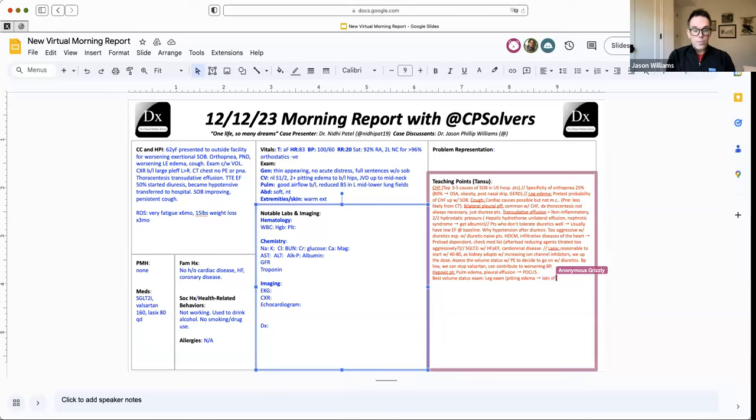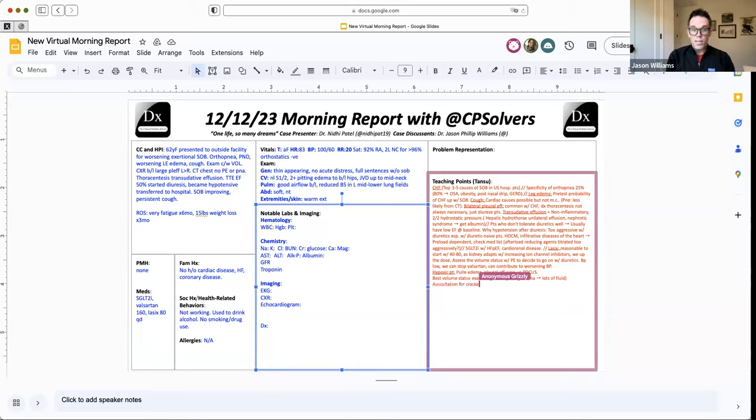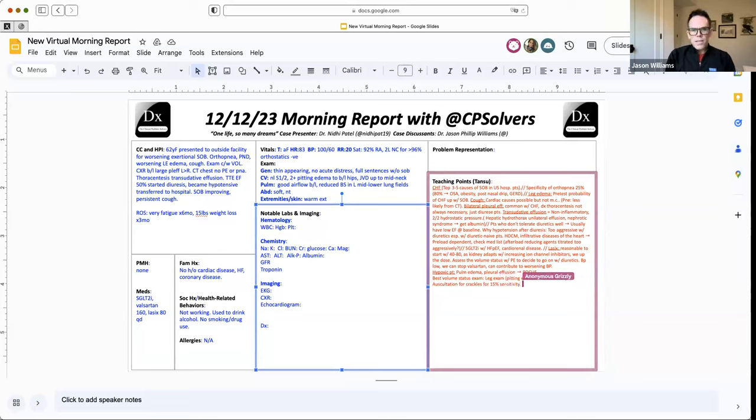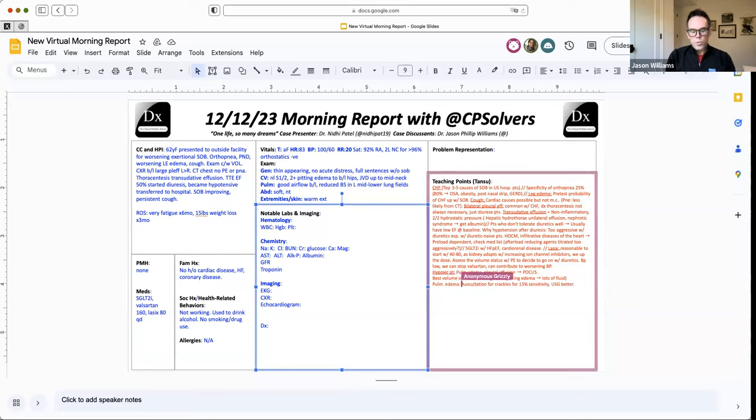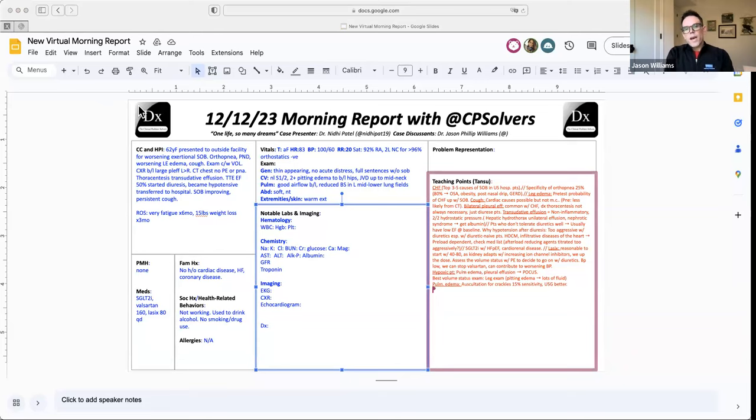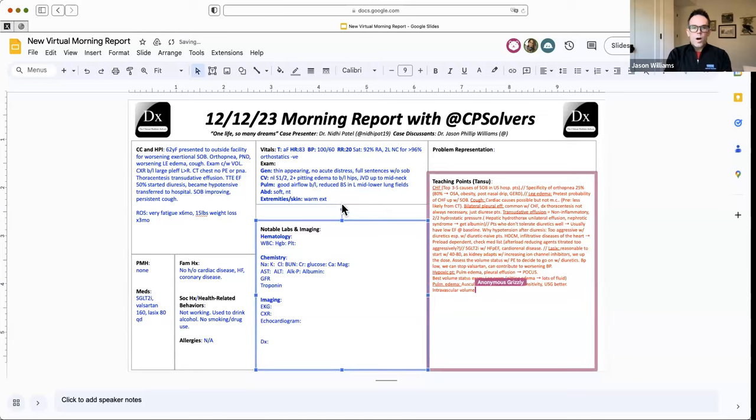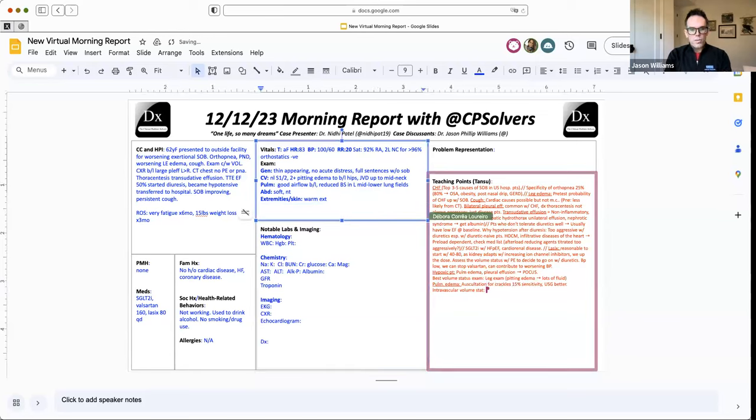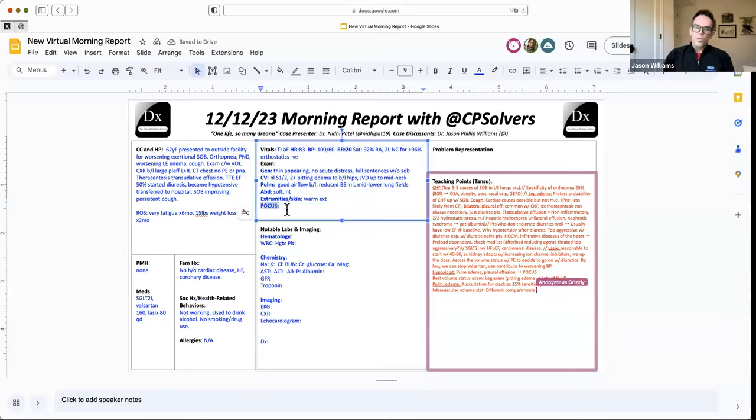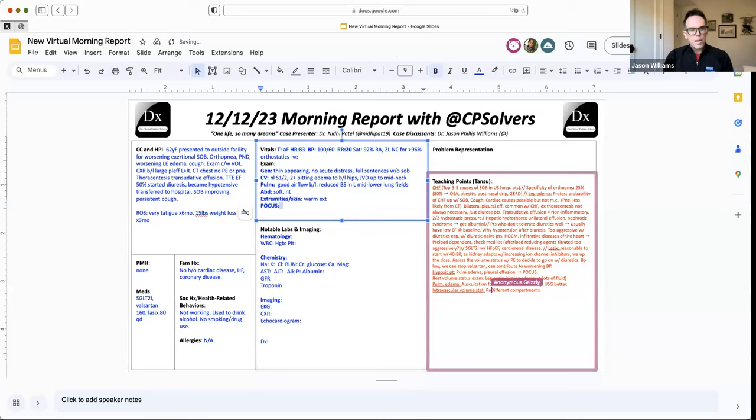Inpatient and many providers will guide their volume status management, mostly based on the leg exam. Unfortunately, auscultating for crackles, the sensitivity for pulmonary edema, if you're listening for crackles, can be as low as 15%. So even though we don't hear crackles here on exam, ultrasound is much higher sensitivity for detecting pulmonary edema. And this kind of decreased breath sounds in the lower lung fields, particularly on the left side, you wonder if that is residual pleural effusion. Maybe they did the thoracentesis on the right side and the left side still has a large volume. And then I think about what is the intravascular volume status of these patients? So I think the way to approach volume status is in different compartments. I don't think it's fair to use a broad brushstroke to say this patient's volume up, this patient's volume down.